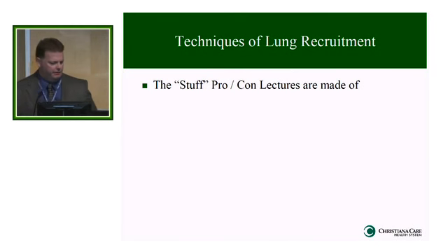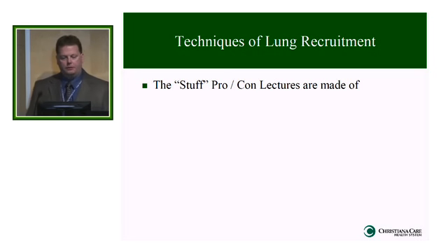So before I start hitting some of the techniques, and I sort of would joke with you, again, back to APRV, you're going to hear a lot from me about PEEP. Well, APRV is PEEP, right? Or CPAP. And you're going to hear a lot from me about sustained inflation to do a recruitment maneuver. Well, APRV, that's pretty much what it is. So as I said, APRV, again, is, to me, one of the quintessential ways that you can recruit lungs. But what are some of the other things?